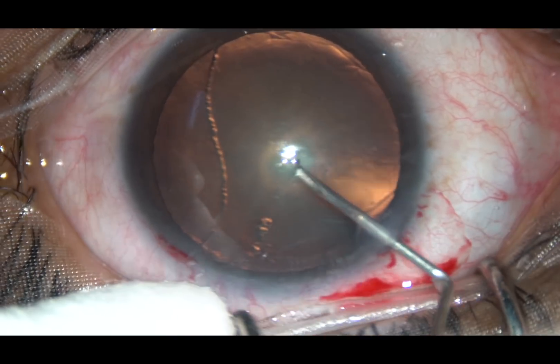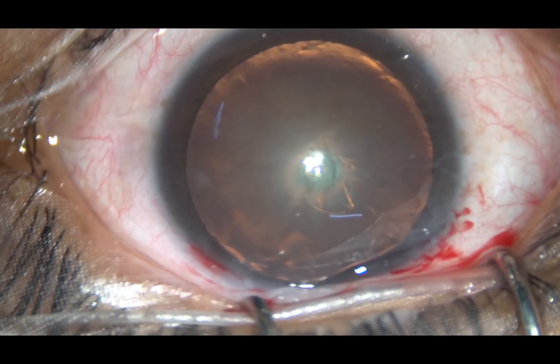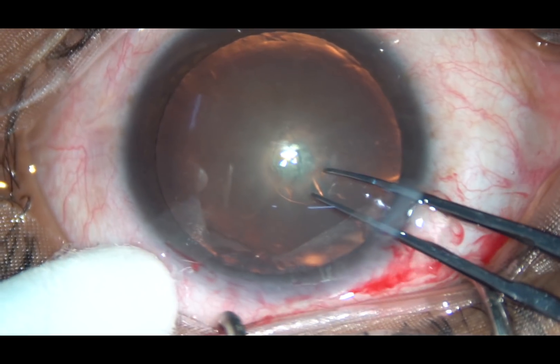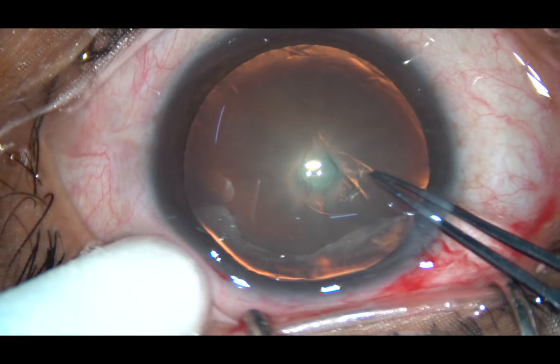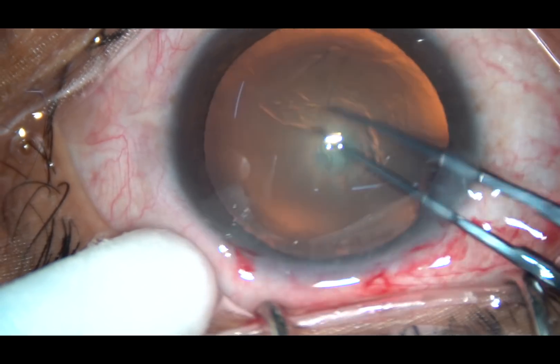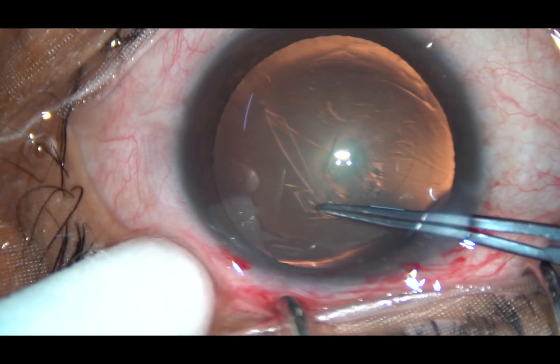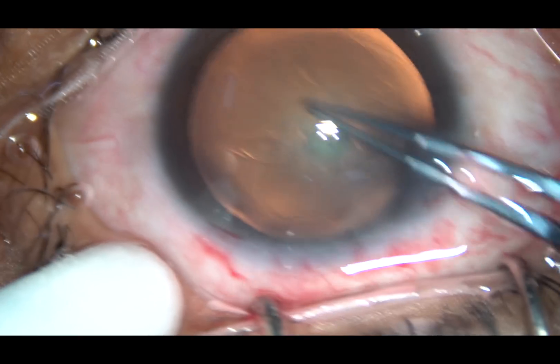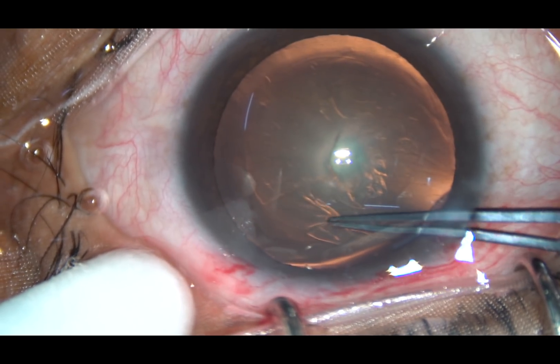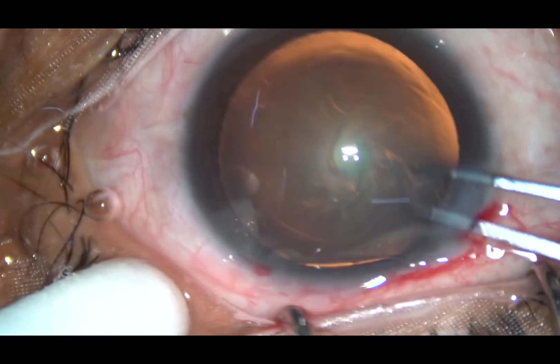The anterior capsule is incised with a bent 26-gauge needle. I hold this capsular tag with the Utrata forceps, go anticlockwise, and remain at a certain distance all around from the margin of the pupil. And thus I am doing this continuous curvilinear capsulorhexis.